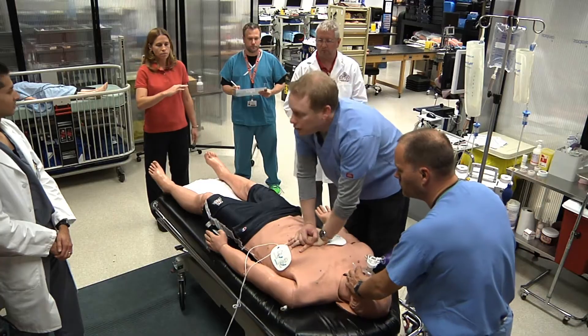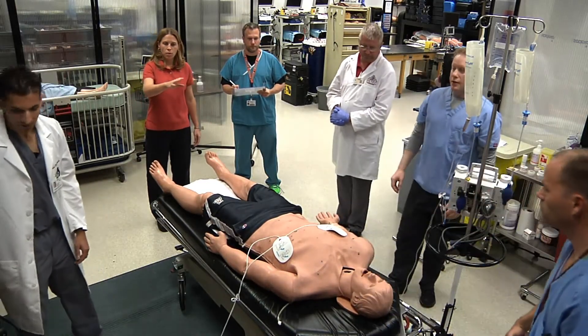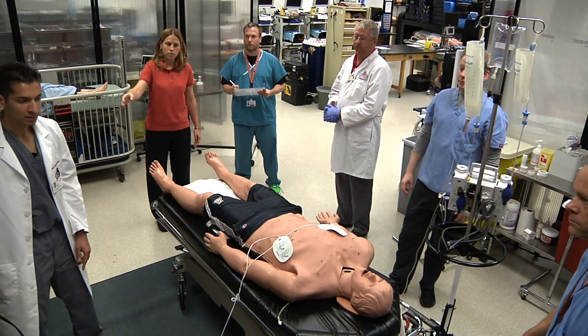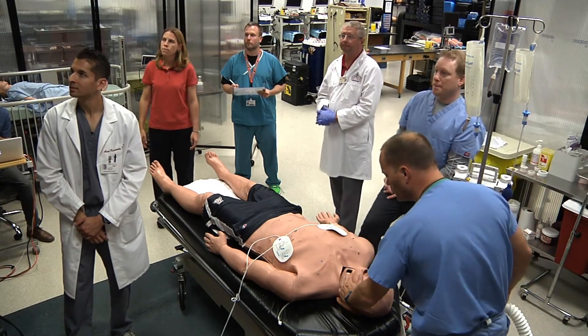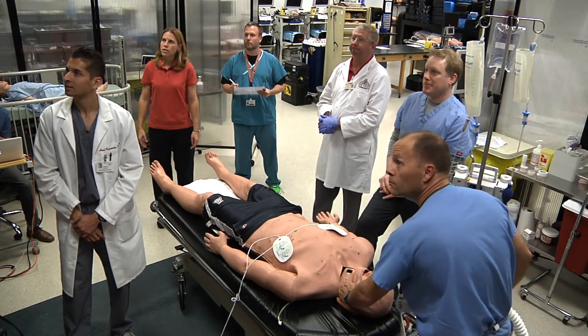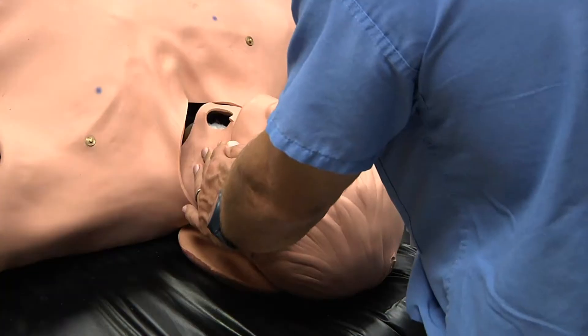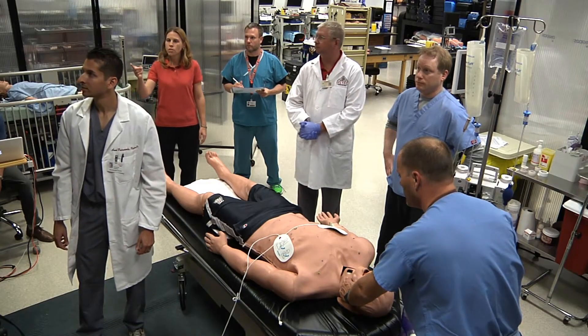Let's go ahead and clear the patient. I'm clear, you're clear, we're all clear. Defibrillate now. Shock. Let's assess the rhythm. Looks like we're in normal sinus rhythm. Can someone check for a pulse? Yes, I feel a pulse. And our blood pressure is 120 over 80.